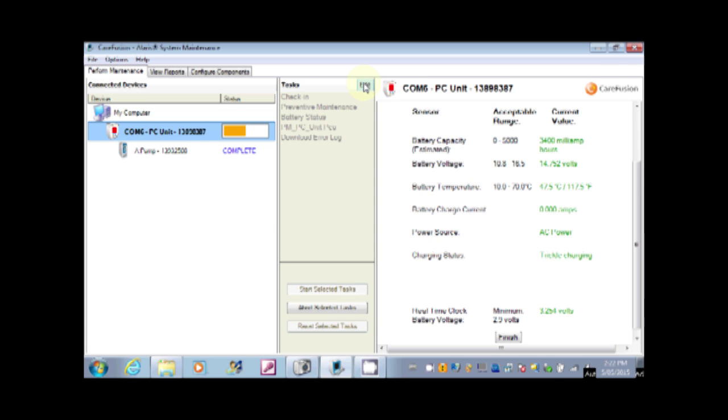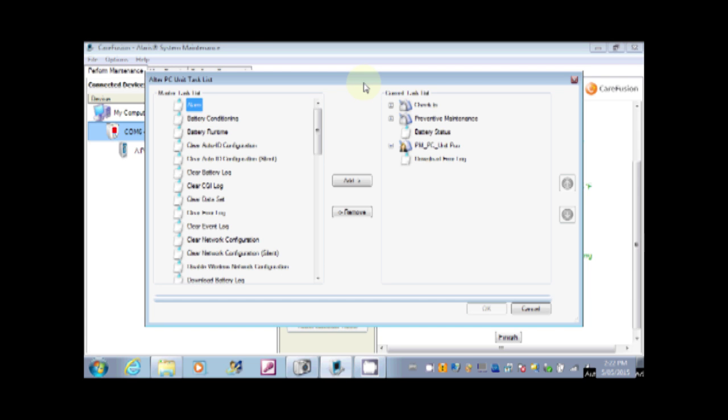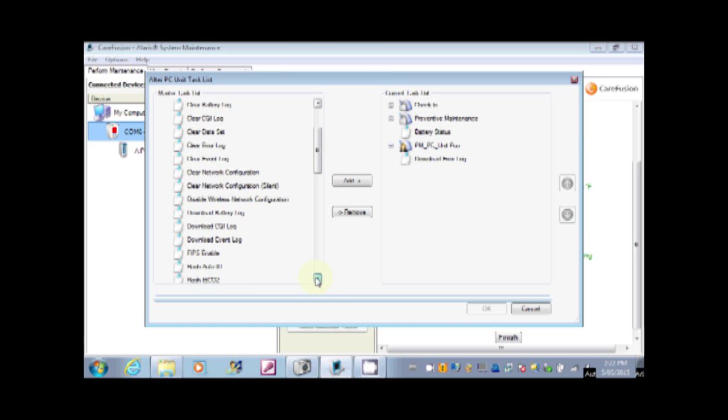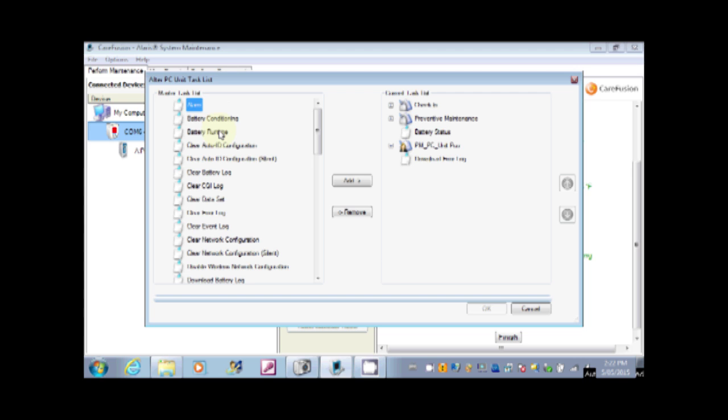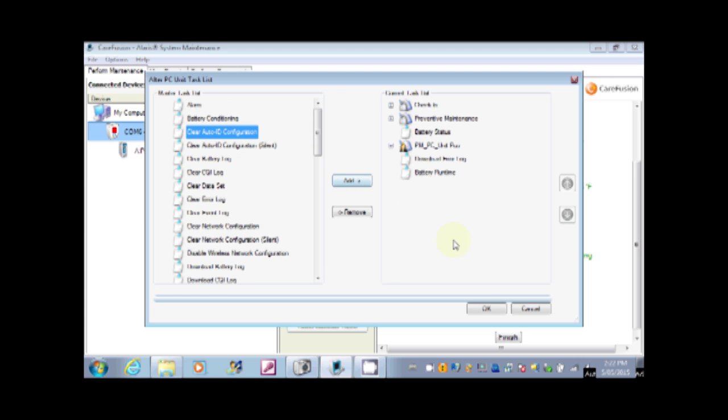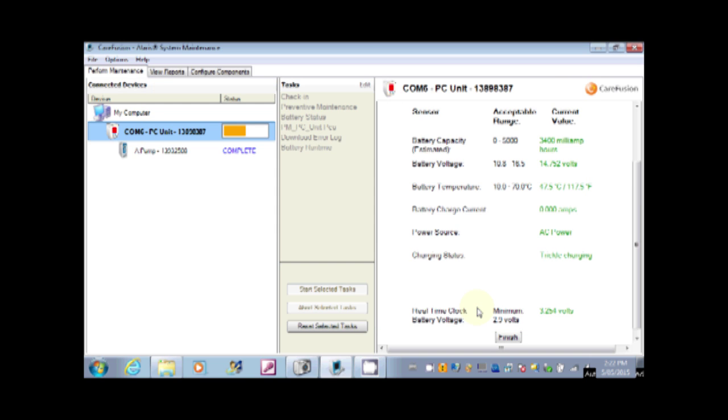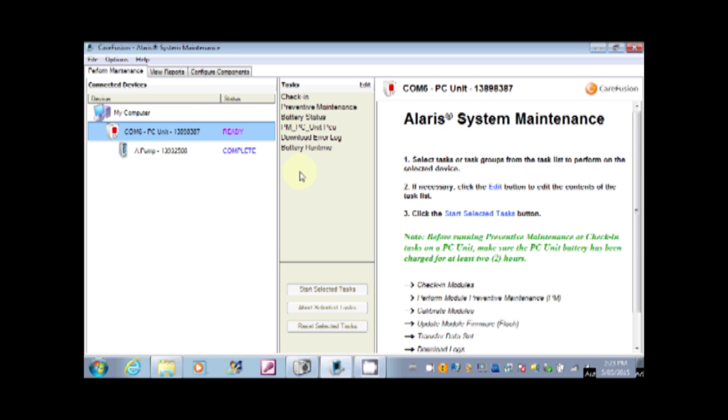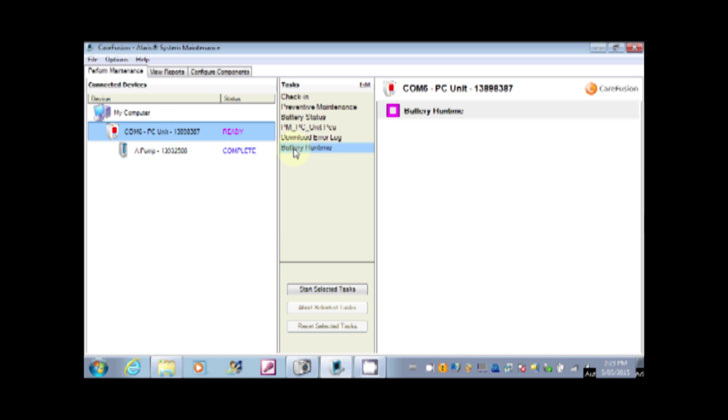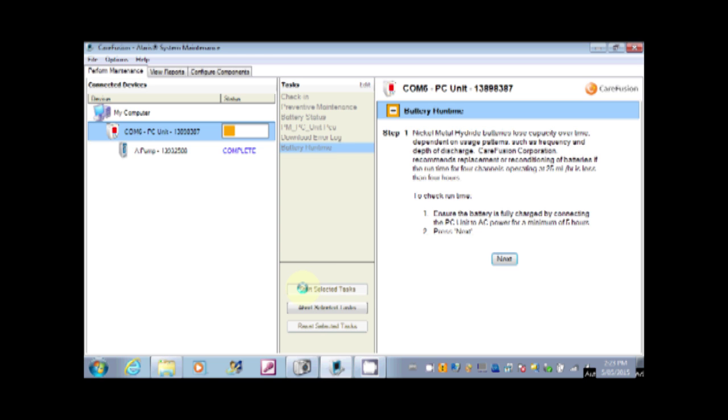Now have a look at adding and removing tasks. You can see we have a big long list of tasks to choose from. We will just pick one at random, battery run time, and add it. You can see that it shows up in our task list. Before we can select it we just need to reset. And we can select it and start the test.